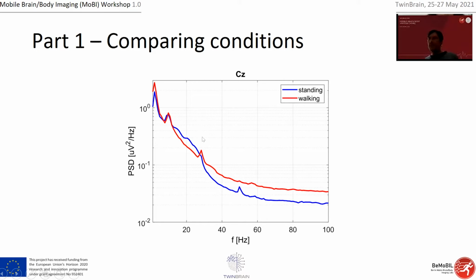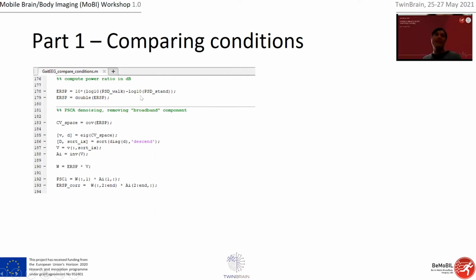That's exactly what we expect. Meaning the overall shape, the 1/f shape, is the same, but there are still some differences we think are worthy of further analysis. So what we can do with those, we just have the PSD walking and the PSD standing.